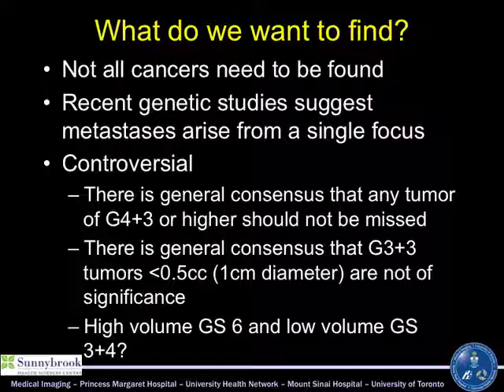And so as we move forward then we say, okay, what is the threshold? What do we need to detect with imaging? What is clinically significant disease, and how can we take this information and synthesize it into an imaging paradigm?